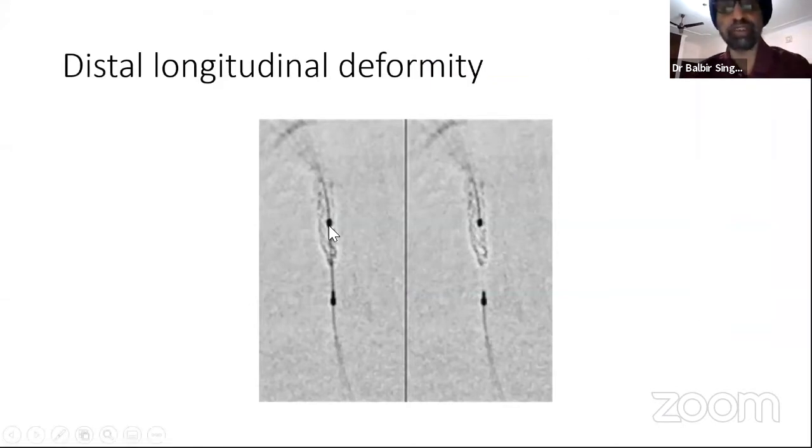This was a difficult lesion to cross with a stent. So there was a buddy wire on the side of it. Unfortunately, the buddy wire was not removed while the stent was deployed. And when the buddy wire was removed, you see this kind of stent deformation. So this indicates problems. This can sometimes lead to no other balloon crossing this lesion, and then you have to use many other techniques to get across it.